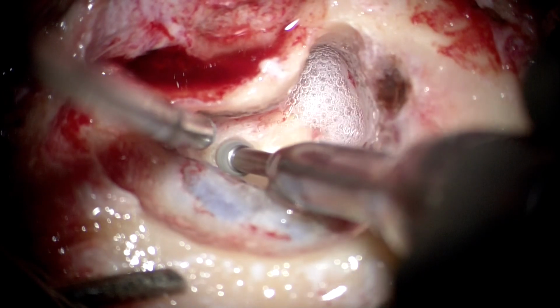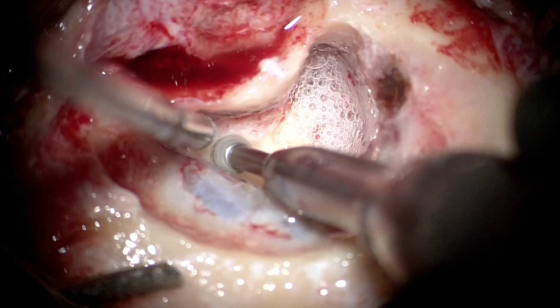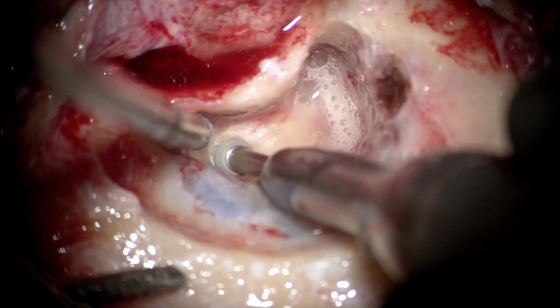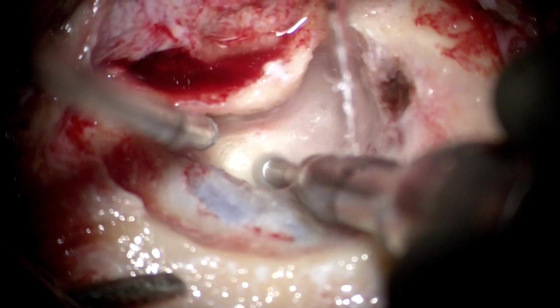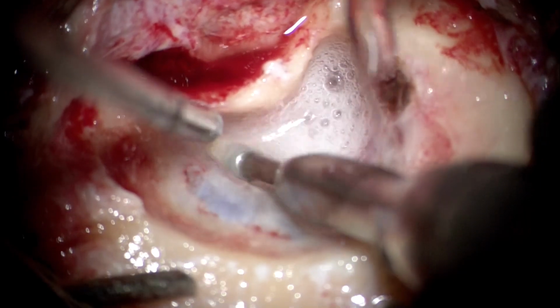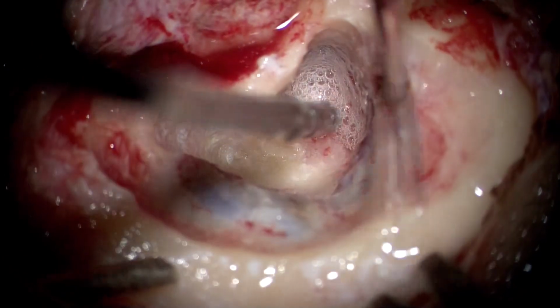Not too much, to create perforation and damage, but a feather-light drilling does not work on the labyrinth. It needs a certain amount of pressure, although with the drill constantly moving, to be able to make sure that the labyrinthectomy proceeds at its fair speed.